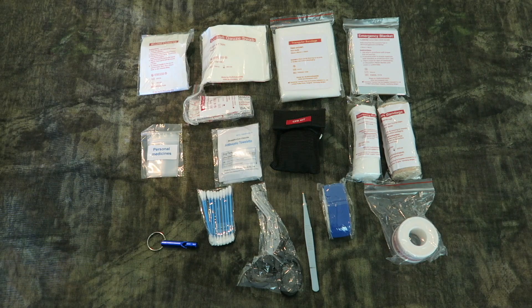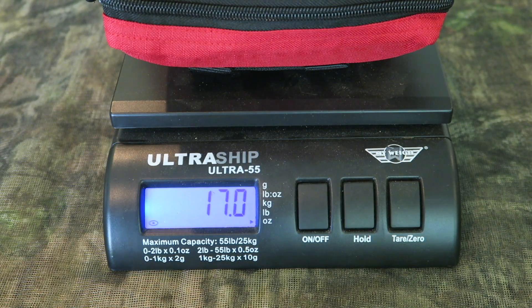That is very, very thorough for what you get in such a small kit. It is 17 ounces.